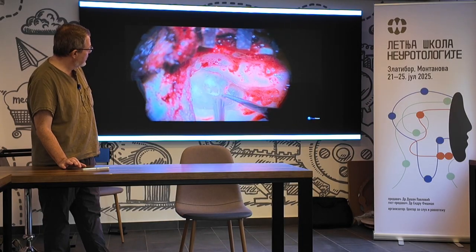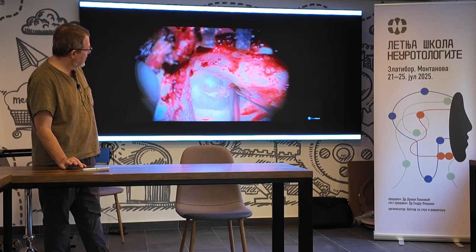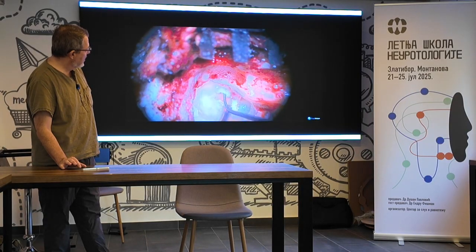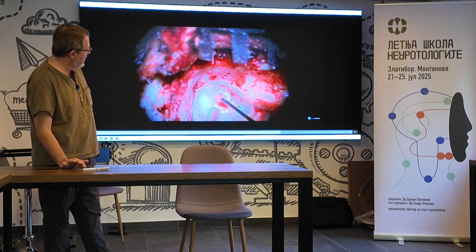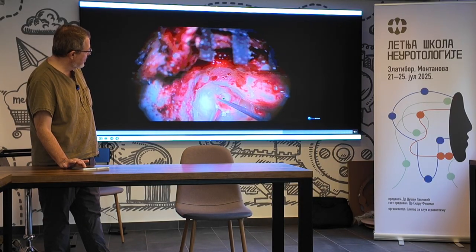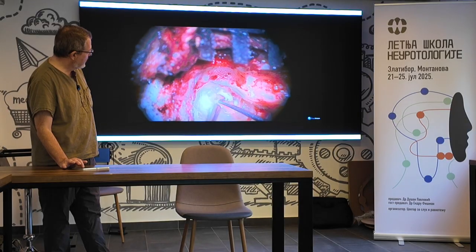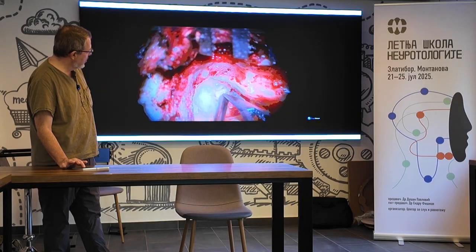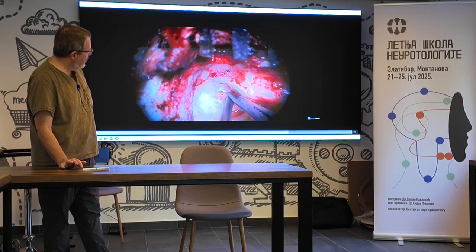So I have to open it up and avoid the facial nerve and find that with the electrical stimulator, and then here the inferior vestibular nerve has been cut, and that's the superior vestibular nerve now. And I'm using the facial nerve probe here to stimulate the facial nerve. It's right there. And I'm verifying that this is not the facial nerve. I just disconnect it. This is very similar to removing an acoustic neuroma. Just cut it, and then I'll go for the cochlear nerve.